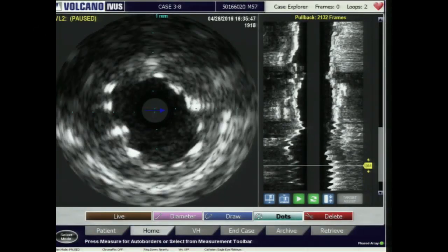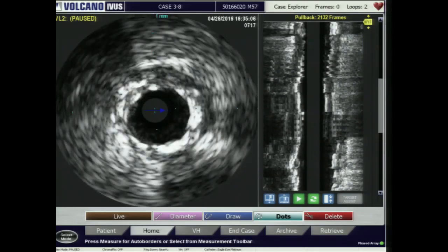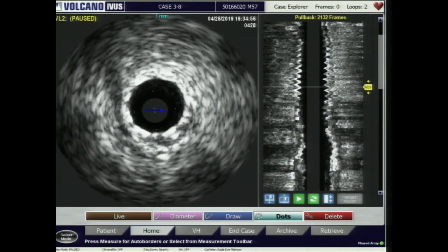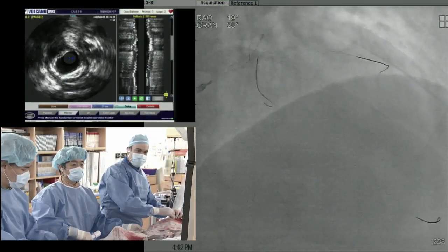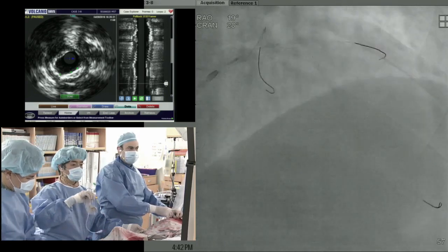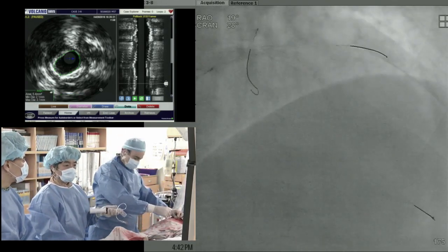And how about distal MSA in the LAD? Do we need to do anything more further down? Well, all the way down, no, because if anything, there's a step up from the distal vessel. How about in the area where there seems to be a little plaque behind it? Is there room to make it a little bit bigger there? Do we need to? Are you talking about at the diagonal or elsewhere? Yes, somewhere there. Well, this is the minimal area. Yes, that's a little bit more underexpanded distally. Now, this is right at the diagonal, Dimitri. Okay. And this is the one area that probably could be made a little bit bigger. All righty. It's 5.5.